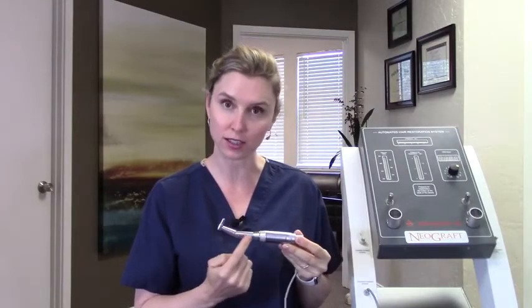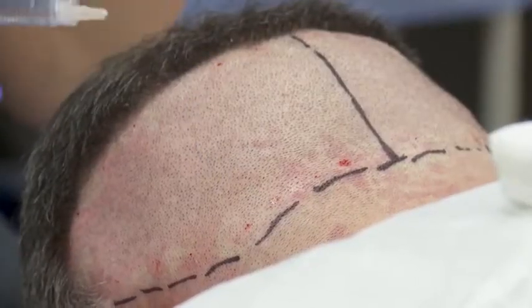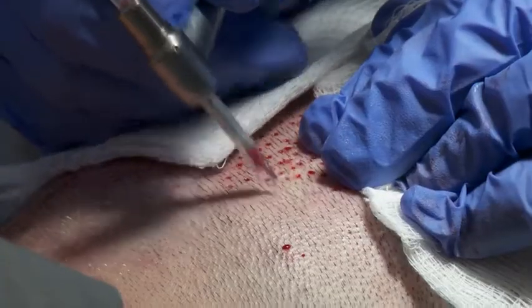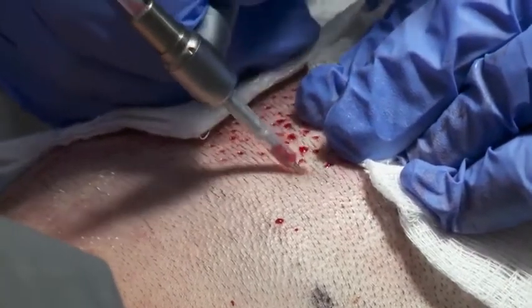Lots of doctors have different devices and the Neograft has certain advantages. What the Neograft does is use this little handpiece — and I'm going to show you that it's angled like this — to help take grafts out of the back of somebody's head and move them to the front. The patient is placed in front of the physician. Usually the back and sides of their head are shaved so the hairs are very short, and then this little handpiece has a tiny punch, which is basically a little tiny tube with a sharp edge. You use that ergonomically — that's what the nice angle is for — to point to different hairs one at a time and pull them out of the scalp.